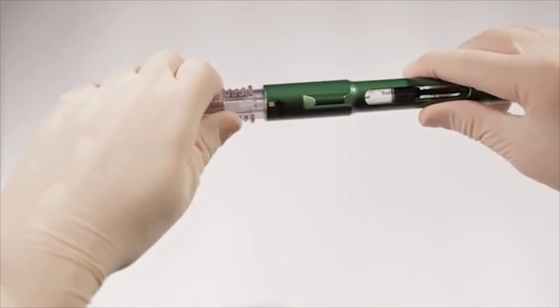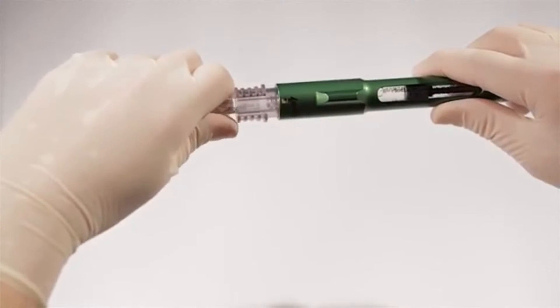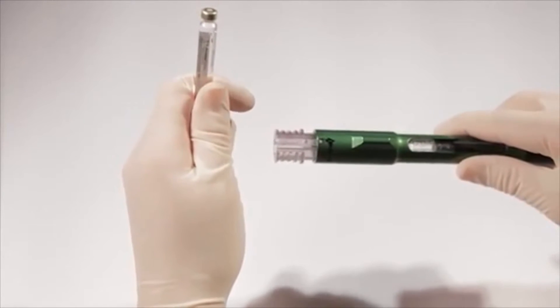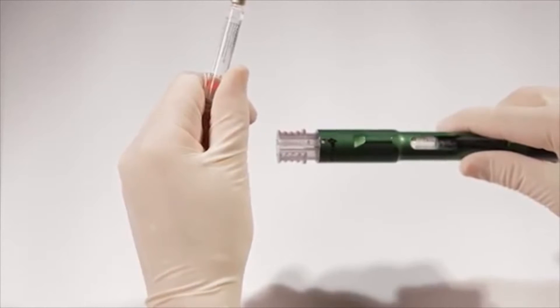This will unlock the 1.8-milliliter cartridge from the connector. At position number one, you can pull the cartridge out. Inspect the mixed cartridge to rule out bubbles, particulates, or discoloration. Use the mixed cartridge immediately.